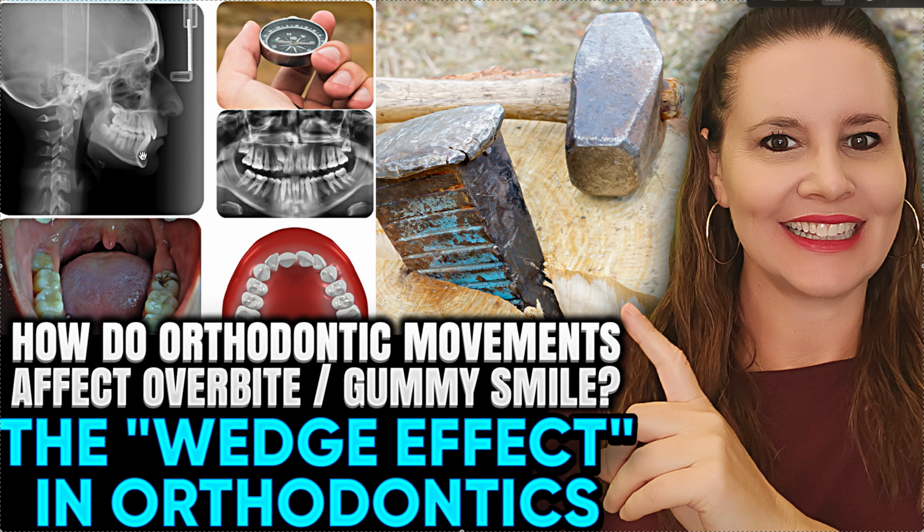I'm not looking at the numbers. This is just my eyeballs getting used to things. This is upright. So this one, you wouldn't want to retract this because it would be in an unhealthy situation in terms of loading, but you could flare it, right? So that's how you use a Ceph to know a little bit more on how to make the right moves.